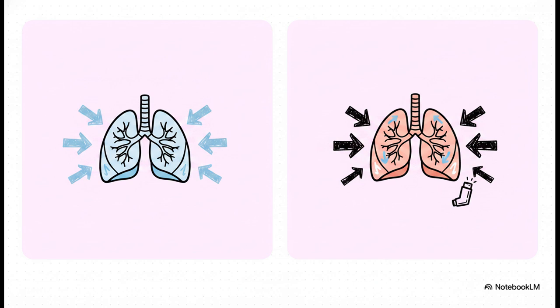So what does that actually mean at the bedside? Well, oxygenation just affects blood oxygen levels, meaning both machines will absolutely help a hypoxemic patient. But ventilation, that's a whole different ballgame. That refers to the physical act of blowing off carbon dioxide. So if you've got a patient with COPD or asthma who is trapping all that CO2, they have a ventilatory problem. CPAP just isn't going to cut it. They absolutely need BiPAP to help them ventilate.